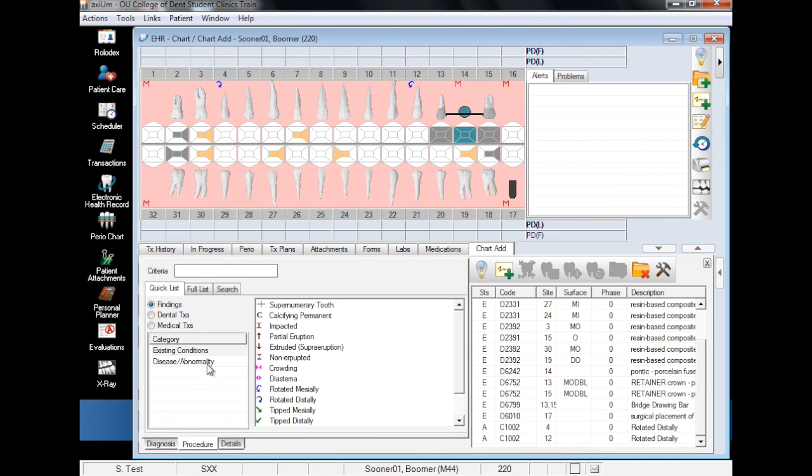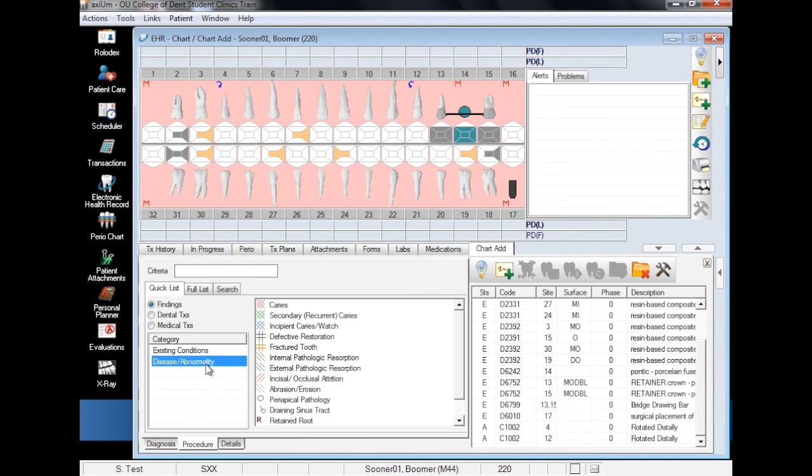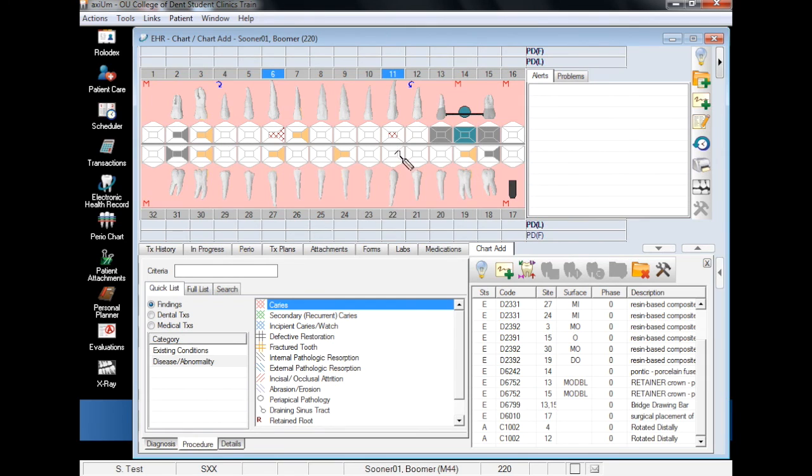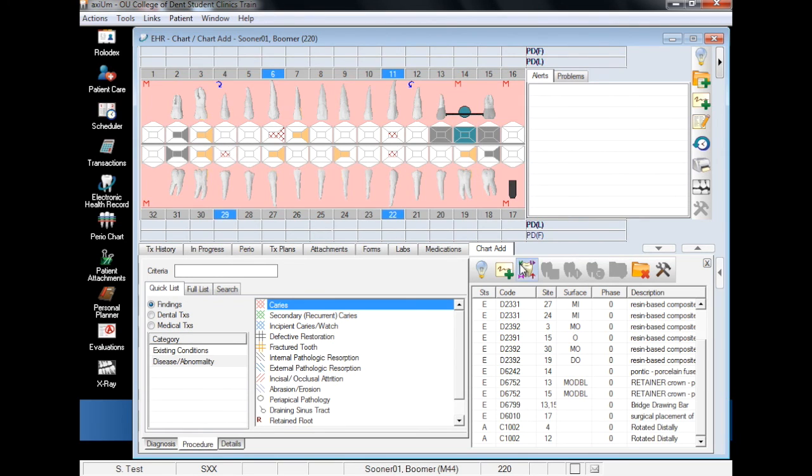It is the same process for diseases and abnormalities. Select the appropriate finding, the affected surfaces, and then the add finding button.